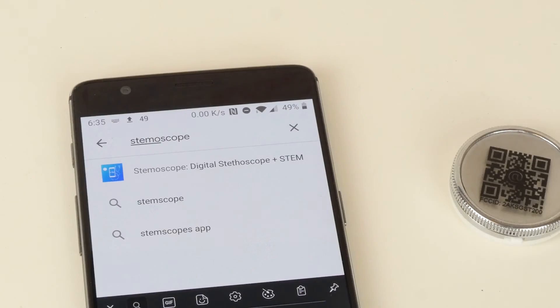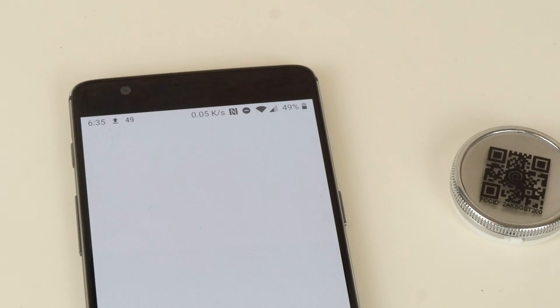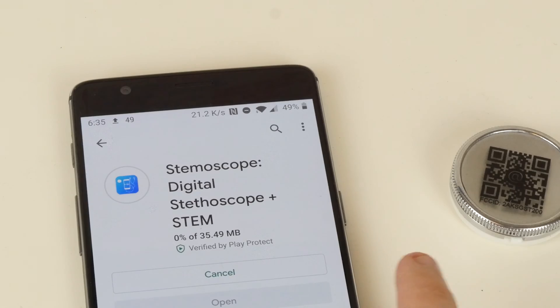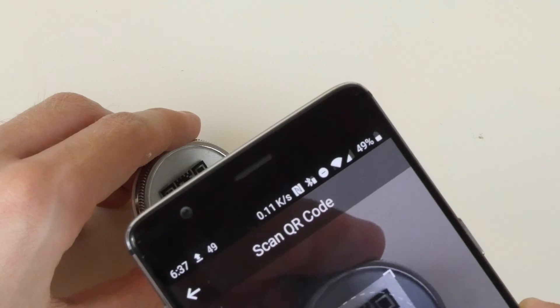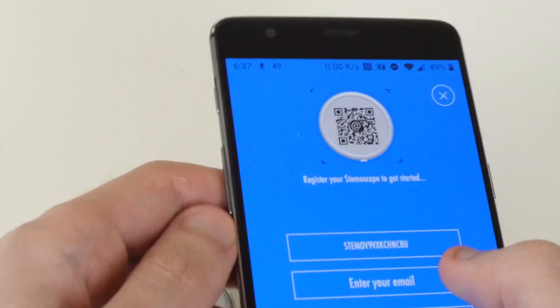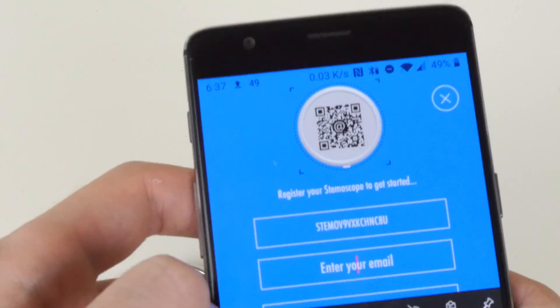Getting set up is really easy too. You simply go to the Stemoscope app in your app store of choice — it's available on both Android and iOS — and you need to scan the QR code on the bottom of the device. You'll then need to put in an email address and register your Stemoscope with your email address, but after that you're good to go.